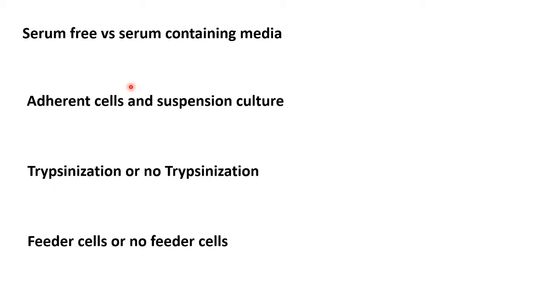Now, you are starting a cell culture and giving them sugar, media, a carbohydrate source, everything. Then, if you are growing hepatocytes or a particular type of cells, for cell division they require external signals, they require growth factors. And if you don't have any idea about these growth factors, then you will be adding serum in the media. What is serum? Serum is a cocktail of growth factors and signaling molecules which can tell the cells, okay, I am here, you divide.